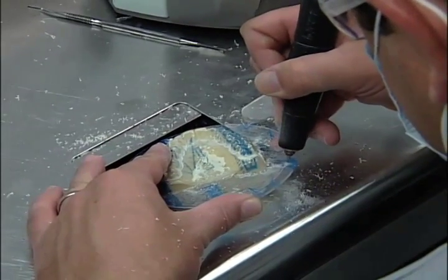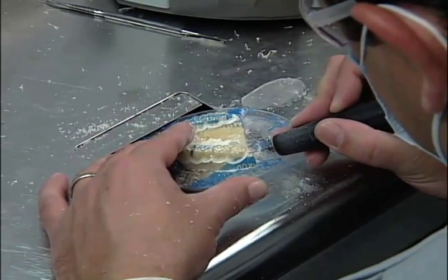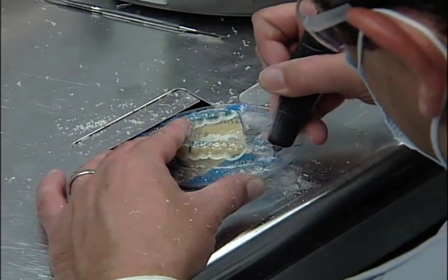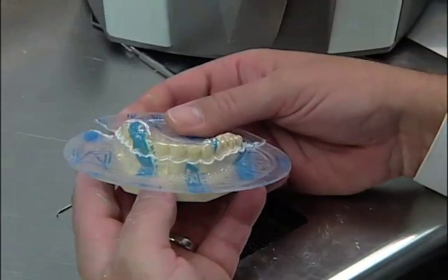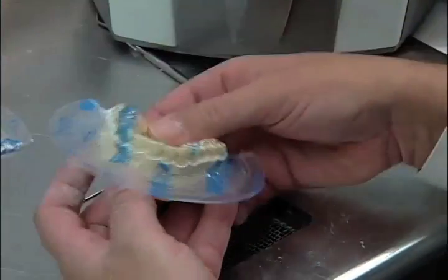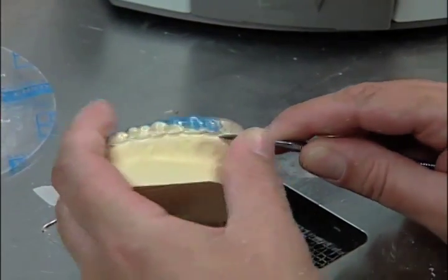When you are on the device, cut two lines from each corner of the model to the edge of the disc. Now you should be able to break away the extra material from the model. Remove the device from the model as shown.